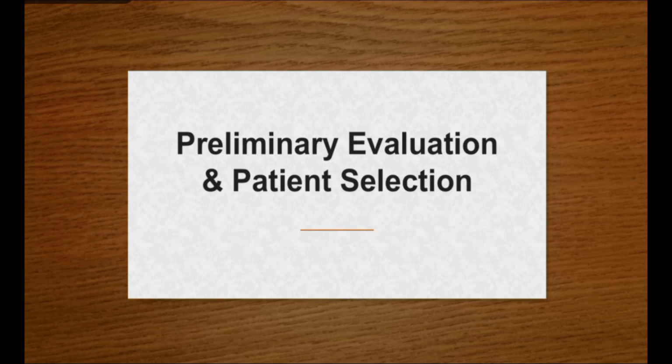Any patient that comes to you, you have to see what he demands, right? So we begin with the case that a patient comes to you, you have done his refraction, visual acuity has been assessed, you have done the subjective refraction, and the numbers have been given to the patient, that is, whether the patient is myopic, hypermetropic, and so on.